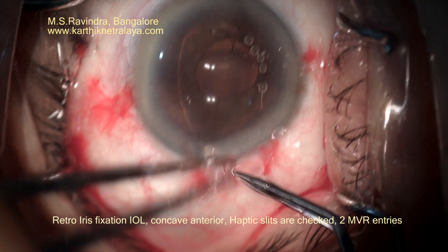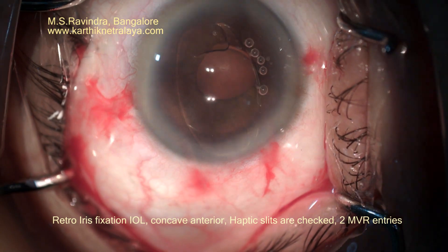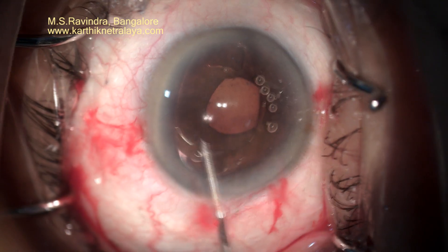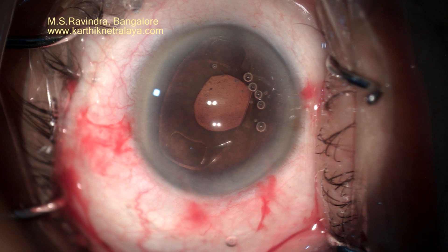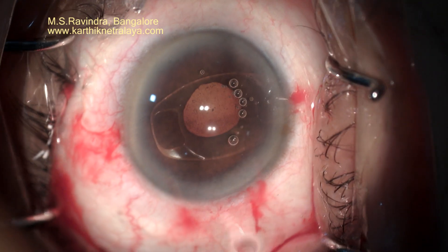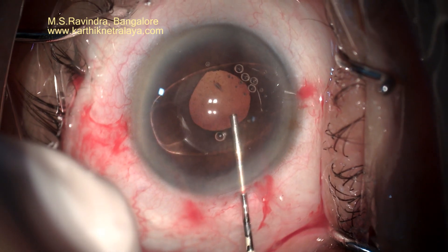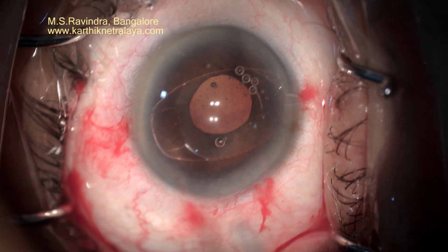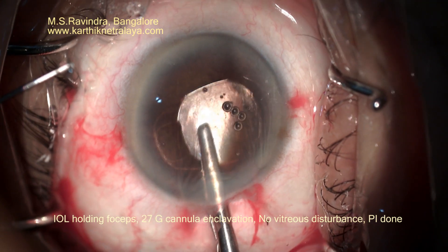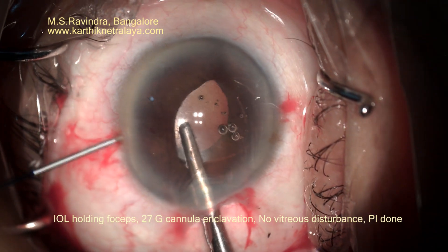An iris fixation IOL was inserted into the anterior chamber after checking the slits in the haptic. Sometimes if the slits are not complete, then enclavation becomes tough. Two MBR blade entries were made exactly perpendicular to the tunnel position.